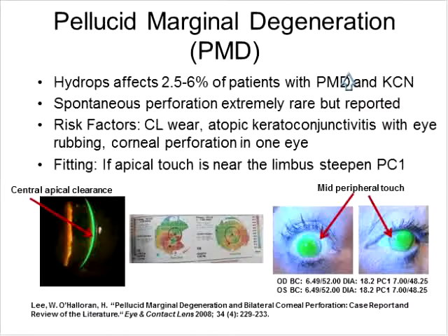Okay, good comment. And it's my understanding that most eyeballs are actually toric, and it can sometimes be relatively easy to get a back toric lens to align with the eyeball. So here's a good question. Have any of the presenters used anterior segment OCT for scleral lens fitting? And if so, has it been successful? And which OCT have they used? And, Dr. Denier, you can chime in on this one too if you'd like. I have not.